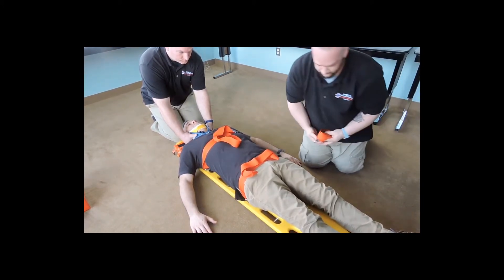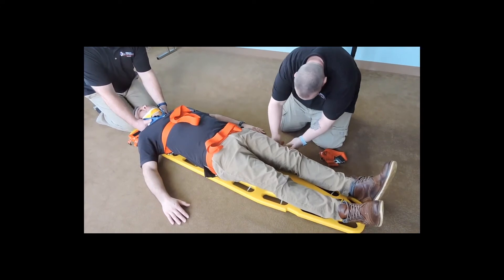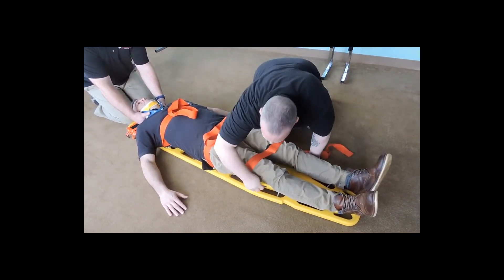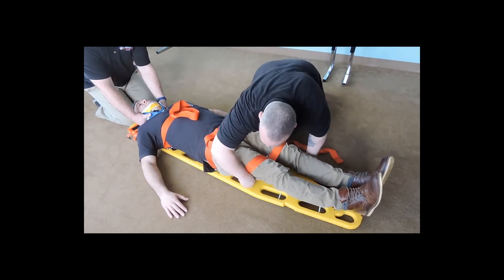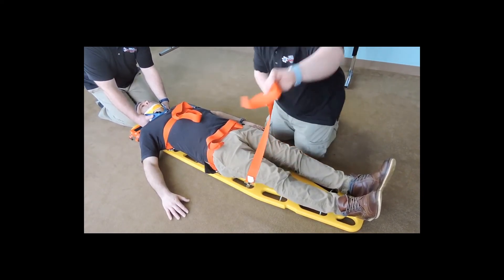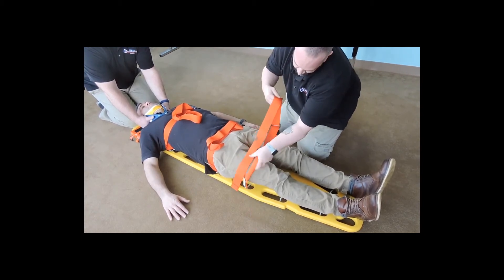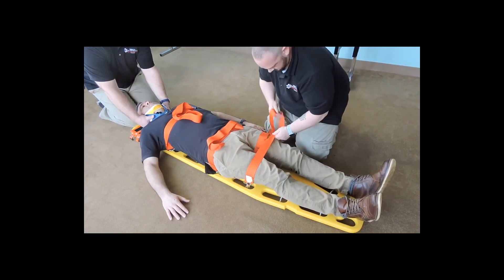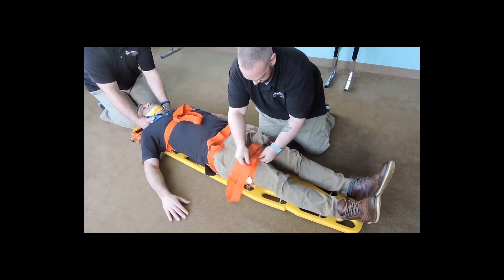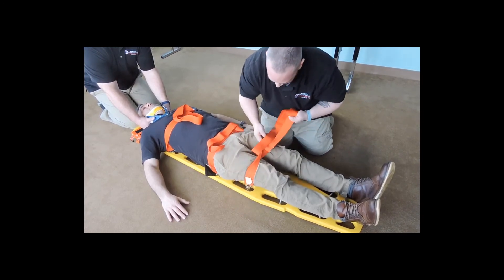With the third strap we want to immobilize the legs, so we're going to come above the knees where we have the majority of the weight of the lower extremities. We would be padding in between the legs to keep them in more of a neutral position — a more comfortable position for our patient. Making sure we're able to feed our straps, making sure we're not over the joint. Padding between the legs and padding our buckle.